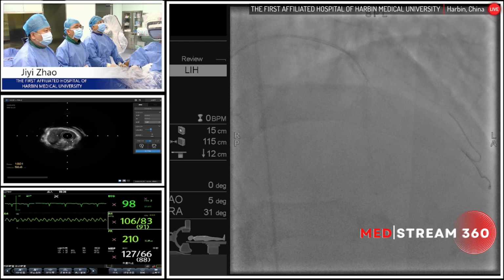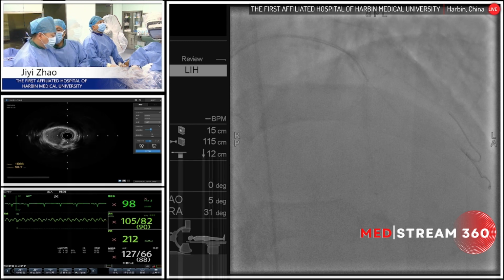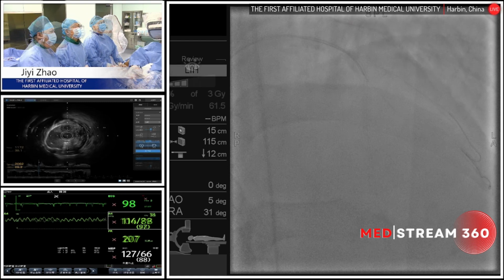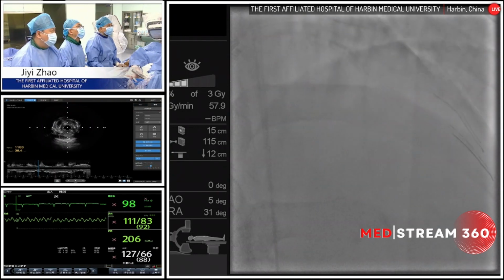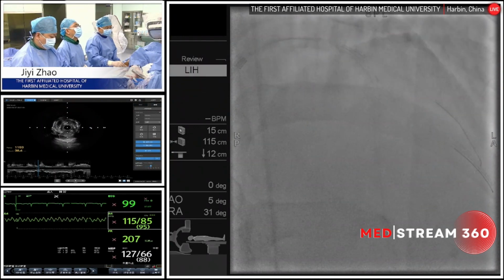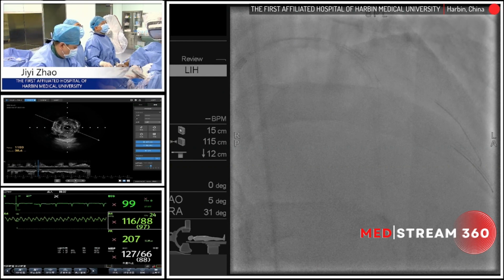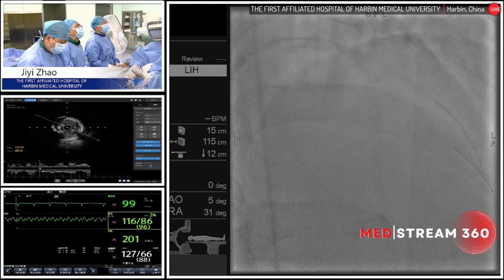well stent expansion. This is after the first diagonal joins in. We can see some superficial cracks of the superficial calcification after the balloon dilation. Here, we can see some well-controlled intima dissection after this 3.0 balloon. But we can see it's controlled. It's not beyond the EEM. So this is also a good prognosis for the stent expansion.